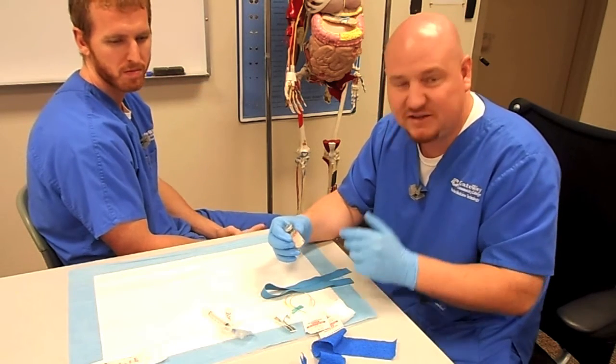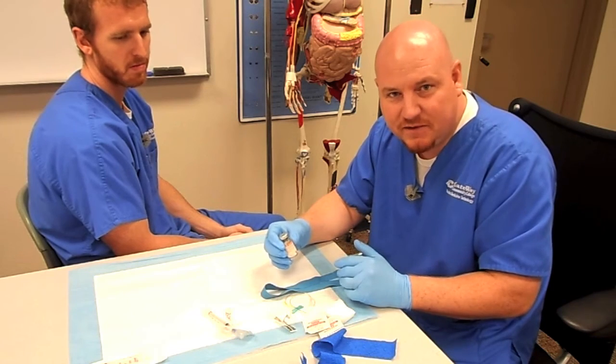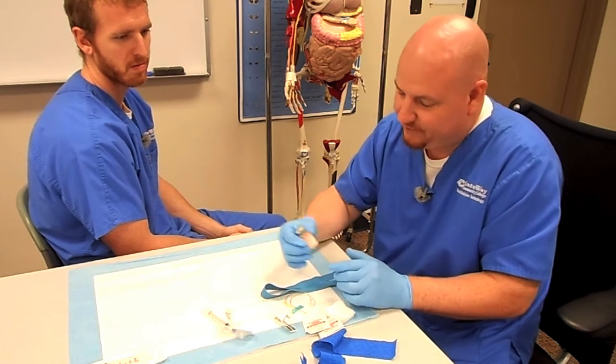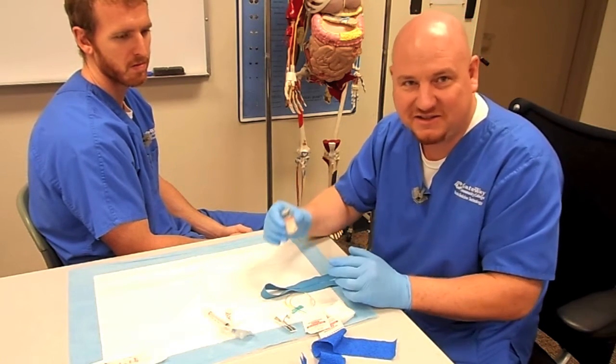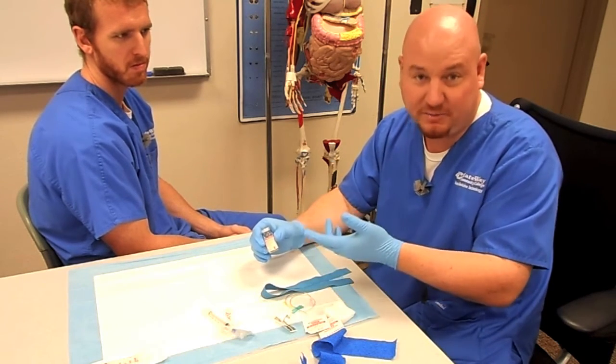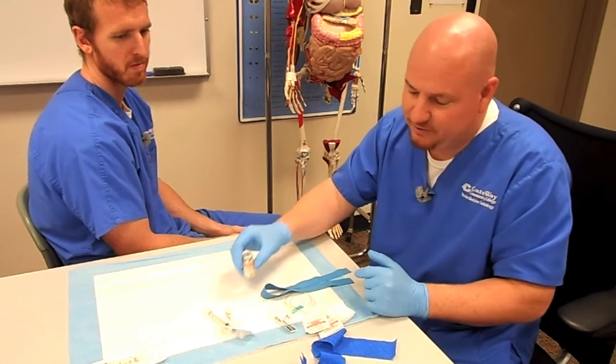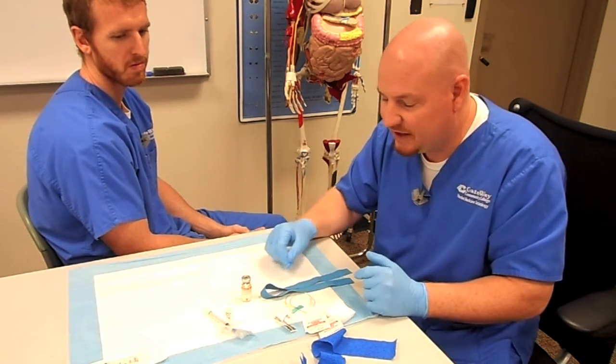At this point, nothing is radioactive yet, so it's perfectly fine to get the blood drawn and get that started. Then when you get down to the hot lab, your five minutes will be pretty much up, and you'll be able to go ahead with syringe 1, syringe 2, and the actual dose.